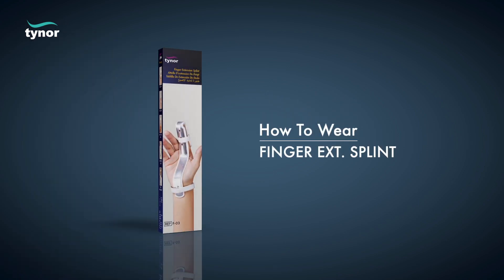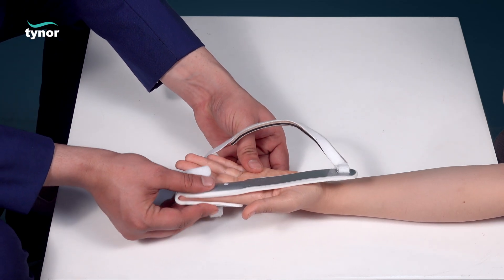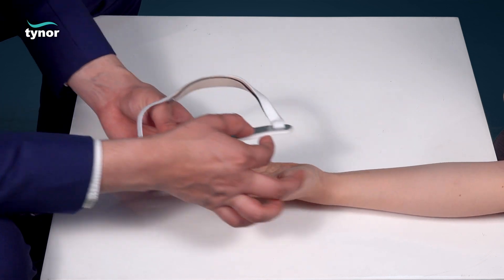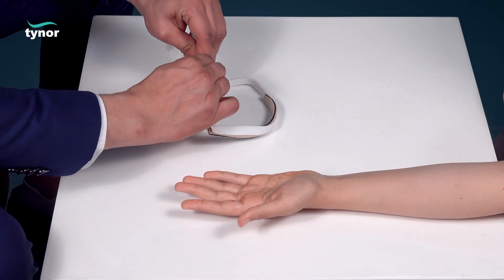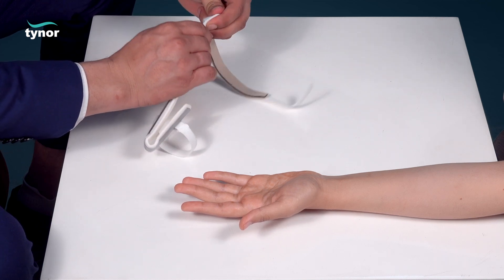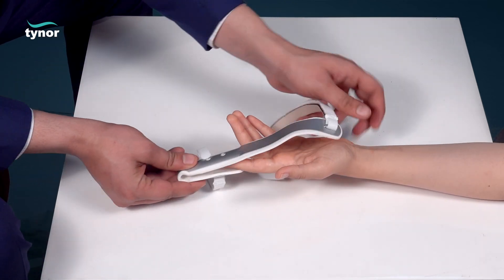To wear the finger extension splint, the injured finger is made to slide into the finger cot to see the need for customization. Now bend or shape the finger extension splint as per your need, then again slide the injured finger into the finger extension splint.